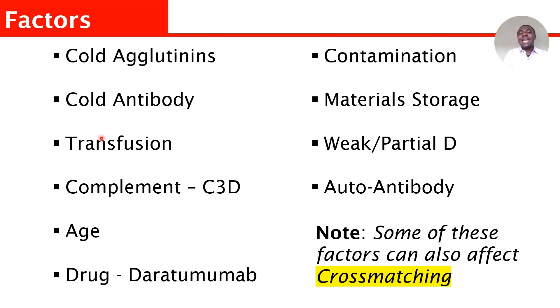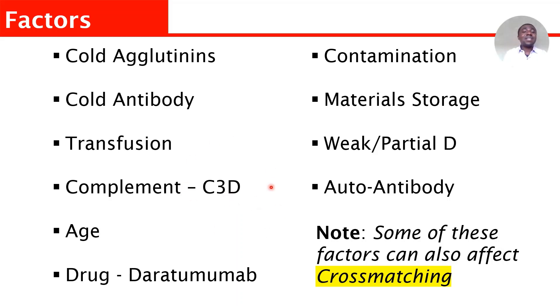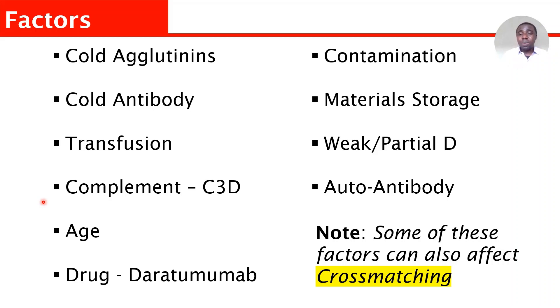Complement can also affect blood group and antibody screening — things like C3D complement. It can affect the antibody screening, antibody panel, and even the blood group. It will give you a pan-reactive result, and it is always difficult to get clean results. It will require a special technique to be able to get the blood group, antibody screening, and antibody panel done.